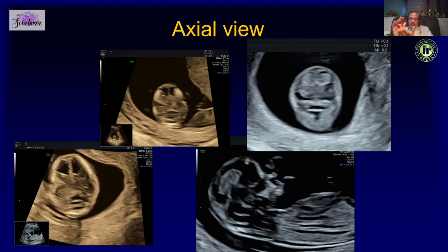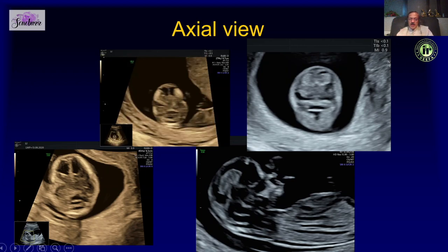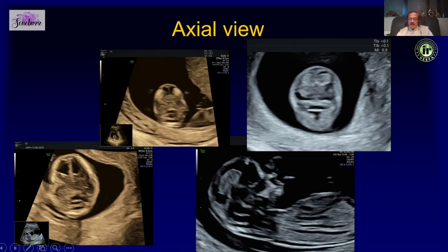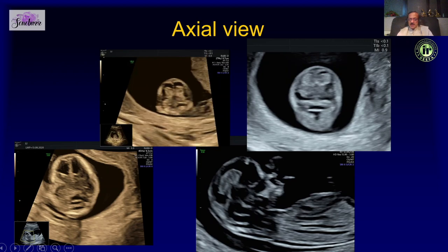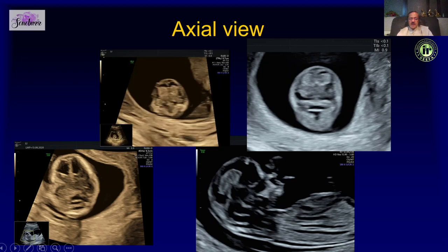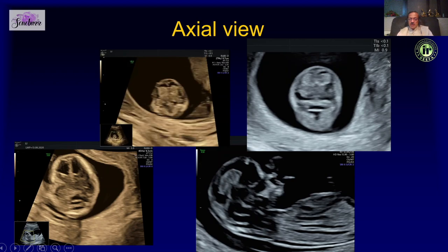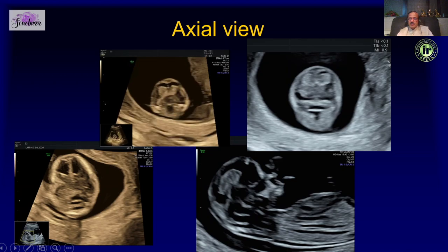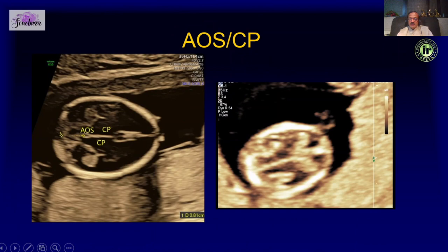Just like what you see in the sagittal plane, similar structures are seen in the posterior fossa in the axial plane — the brainstem, the IT or fourth ventricle, and the cisterna magna. This view can be very important in picking up posterior fossa abnormalities at an early stage.